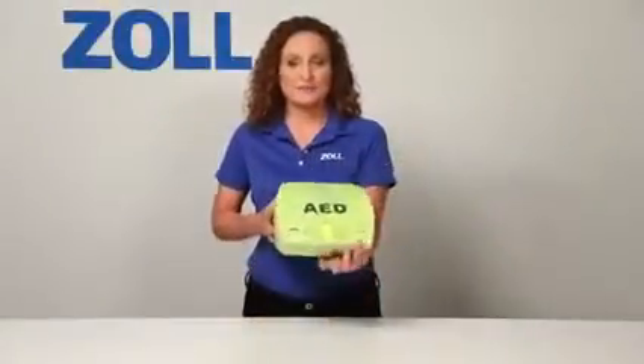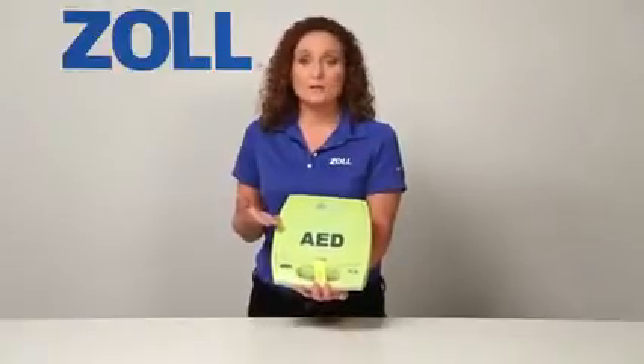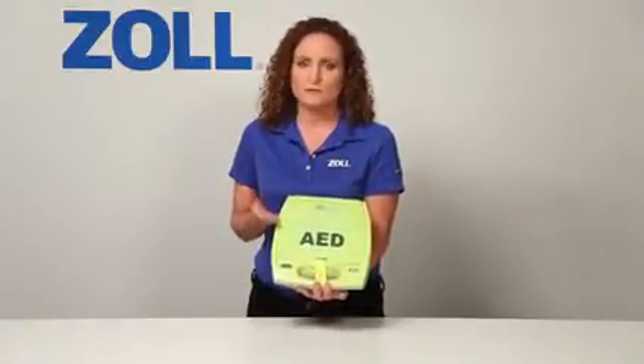Hello, I'm Leslie Zola from Zoll Medical, and this is the AED Plus — an AED that helps you all the time, in every rescue. But don't most AEDs help all the time?